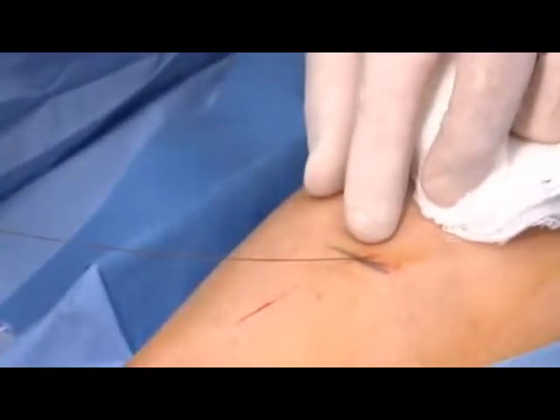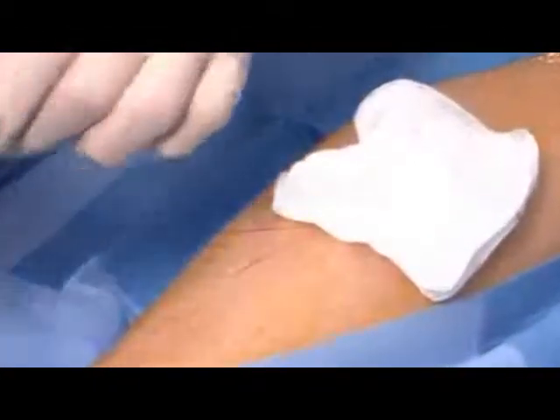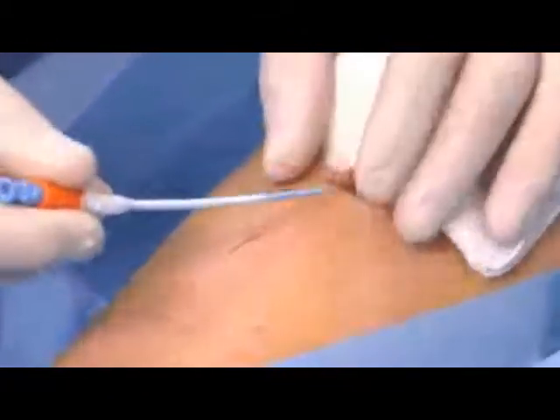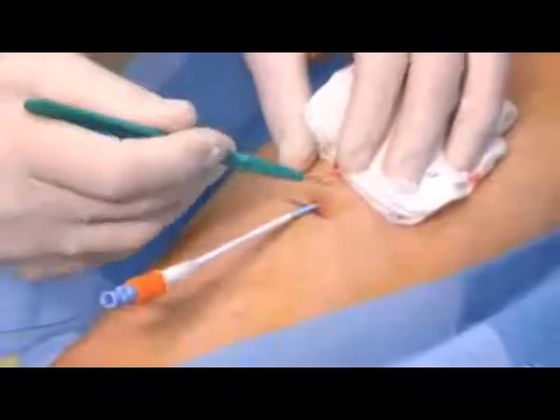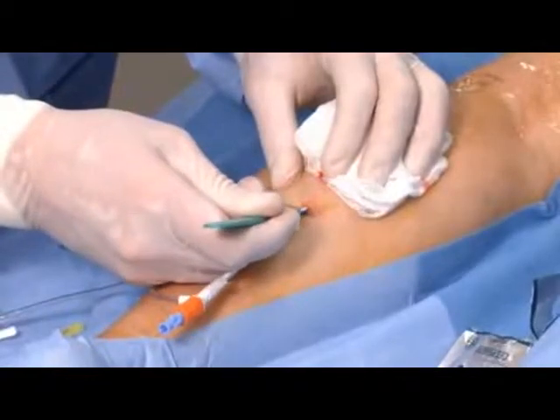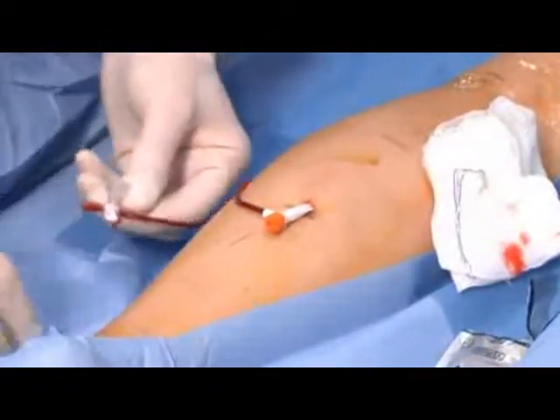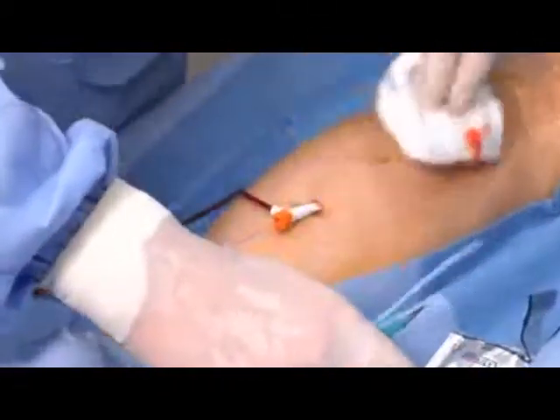We've introduced a small wire in the short saphenous vein on the back of the leg and then introduced this catheter over the wire. This is a commonly used technique in accessing arteries and veins in the circulation. We'll look to see if we have some blood — and we do. That's the proof positive that we've entered the appropriate blood vessel.